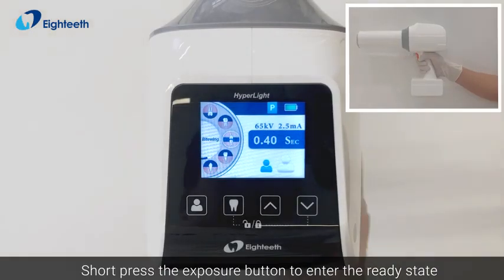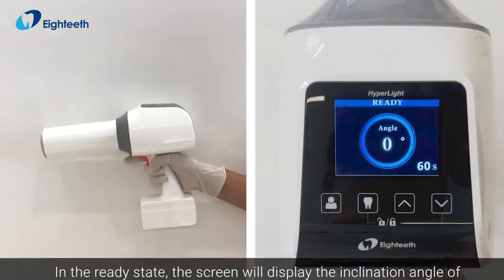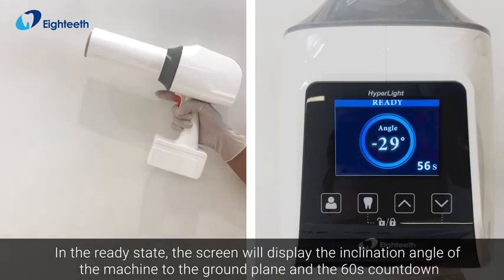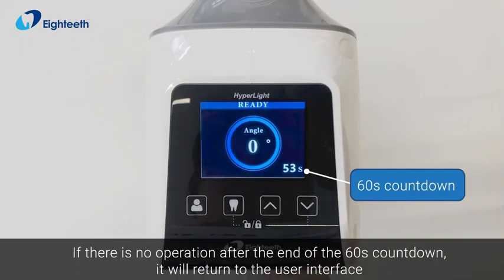To expose, short press the exposure button to enter the ready state. In the ready state, the screen will display the inclination angle of the machine to the ground plane and a 60-second countdown. If there is no new operation after the 60-second countdown ends, it will return to the user interface.